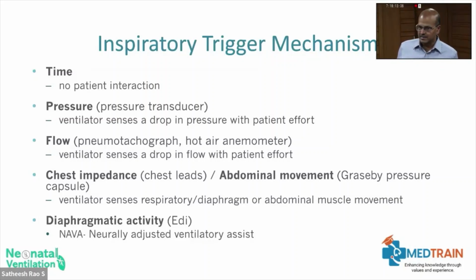And I think the Maquet is coming with a proximal flow sensor trigger for NIPPV. So a triggered NIPPV option is coming up as well. You don't have the hot wire anemometer, but you have the pressure sensor for the ventilator. So for synchronization, in addition to NAVA for non-invasive, we are also getting other options now for NIPPV, which is synchronized, but most of us use non-synchronized NIPPV.